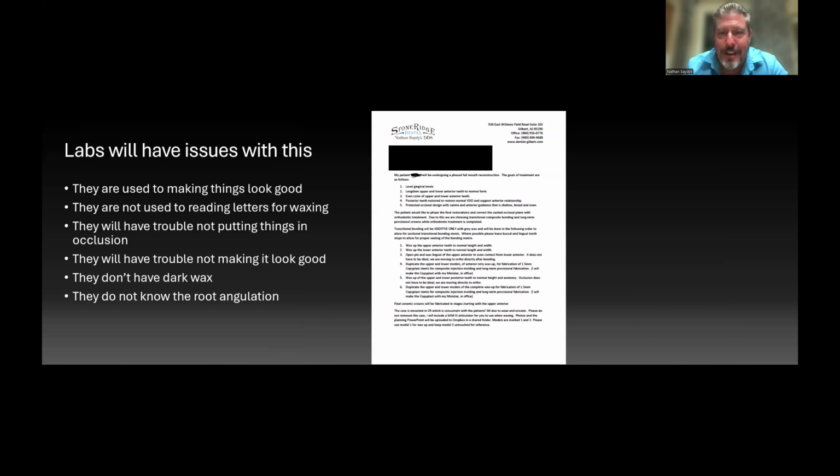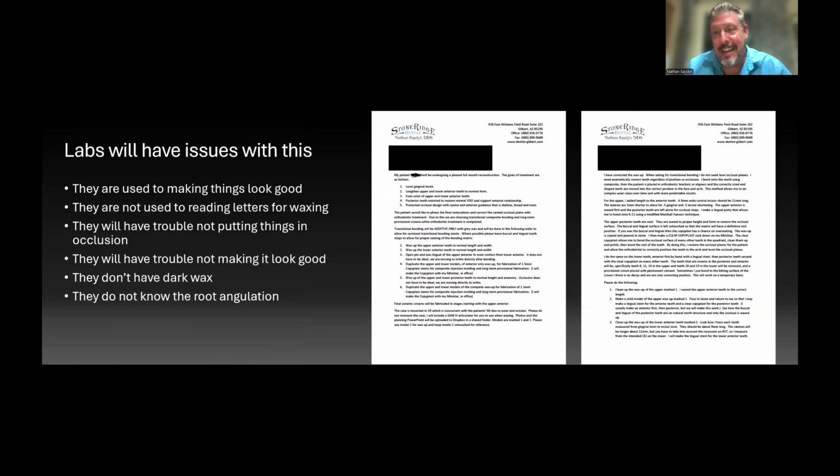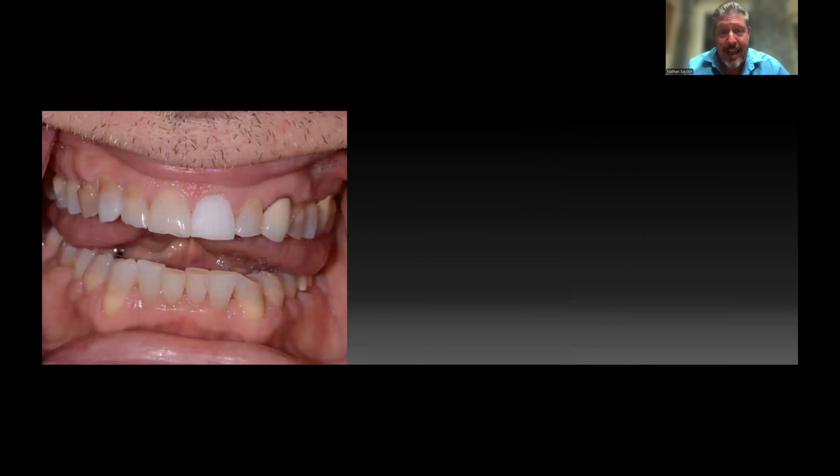So here's a letter that I sent to the lab telling them step by step what I wanted to happen. And I got it back and it was wrong. And so I wrote another letter and sent this to the lab telling them I corrected the wax up, and they sent it back to me wrong again. And the day I got it back, this is the case.